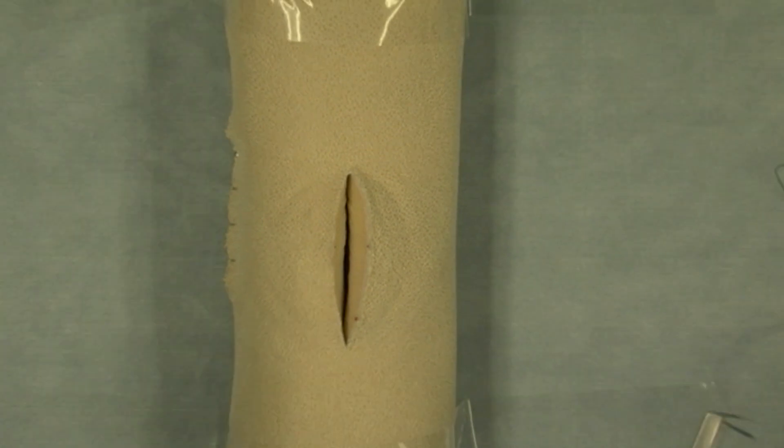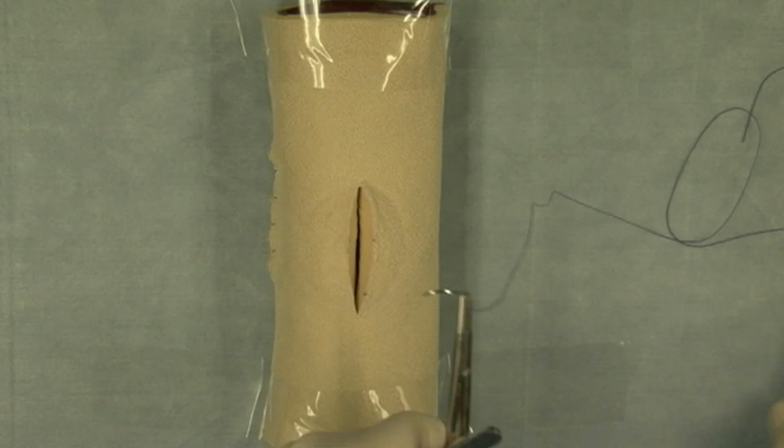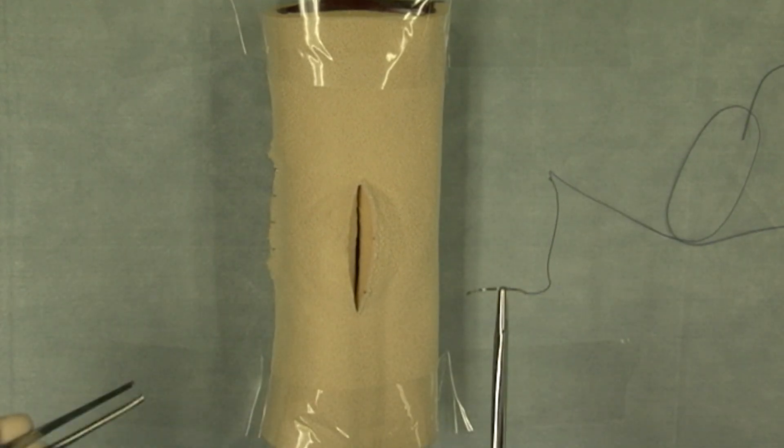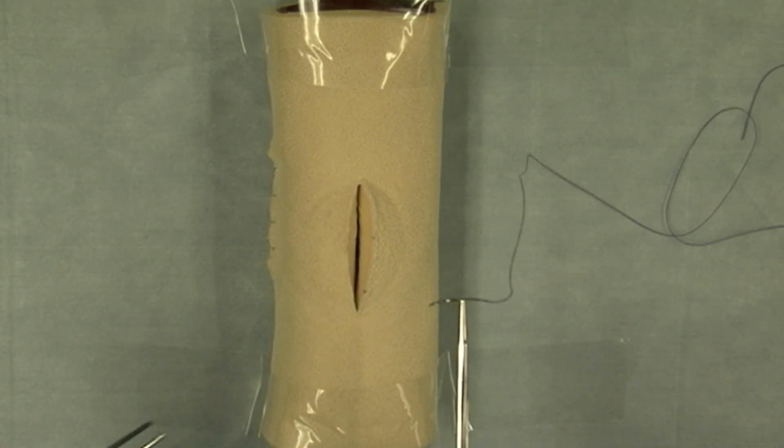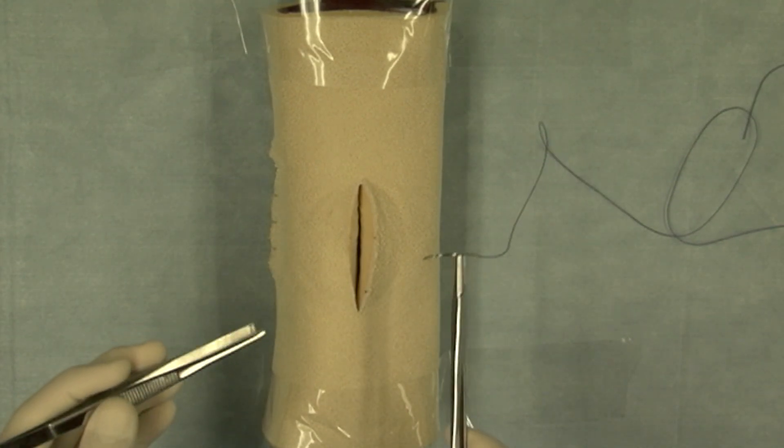I'm going to be demonstrating the near far far near suture pattern, which is a tension relieving suture pattern that's used primarily under conditions of tension on the skin, and so you will be performing this pattern on the skin portion of the daisy.